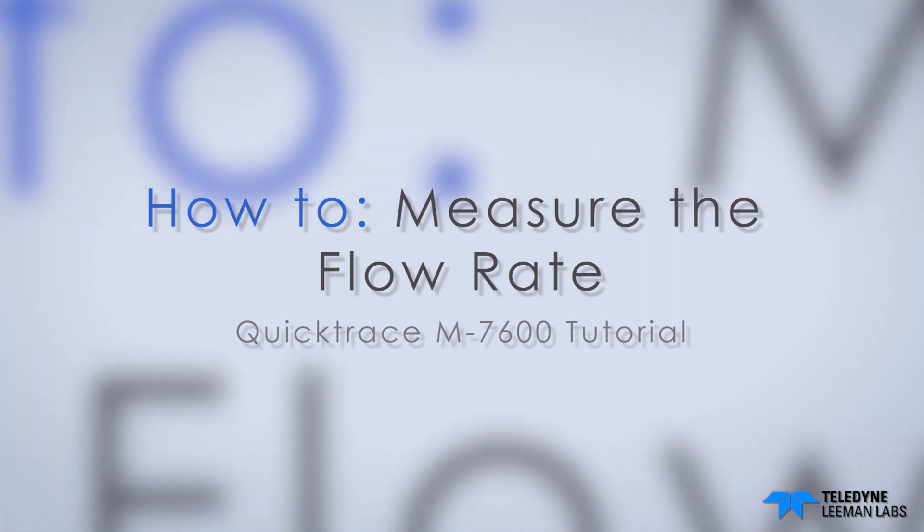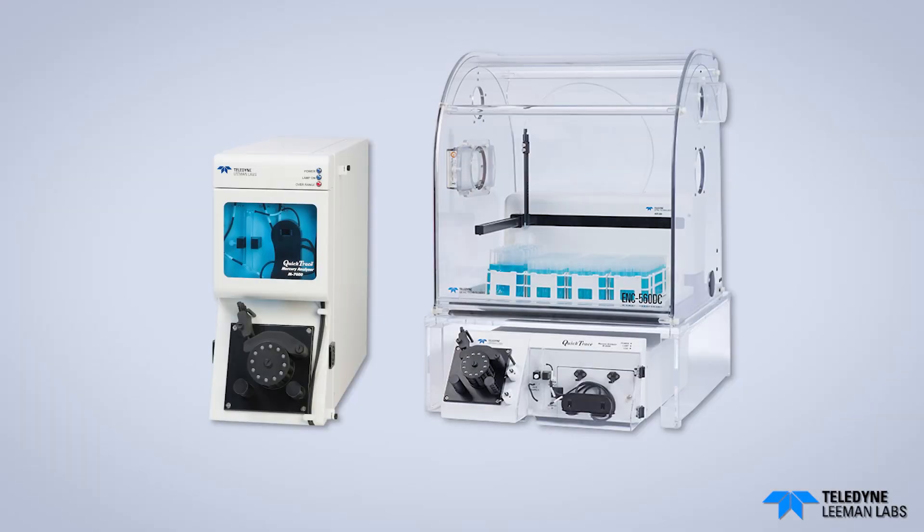Today we are going to learn how to calculate the flow rate for Teledyne Lehman Labs QuickTrace products. We will calculate the uptake gravimetrically using DI water. Since the density of water is approximately 1 gram per milliliter, the weight and the volume of the sample is equivalent.